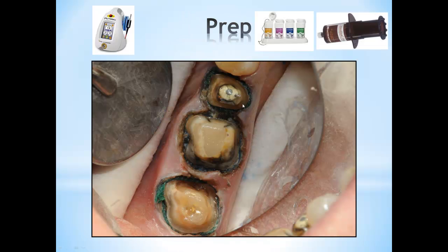So I finally prepped the teeth, and you can see that I removed secondary cavities all around the restorations here, and you can see the margin is very subgingival on number 31. You can see also the crack lines on number 30. Probably one of the reasons the root canal was failing, besides the broken instruments and poor condensation, is that statistically most root canals fail from coronal leakage.